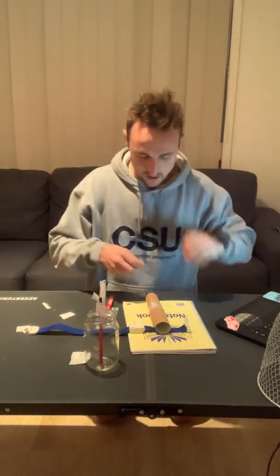I'll use my Tegaderm and place it over the cannula, exposing the bung so I have patent access for medications, and also so I can visually see in case we do blow the vein later down the track and there is fluid buildup.